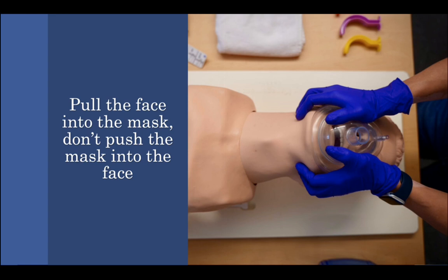So remember, pull the mask up and in, pull the jaw up and into the mask. Don't push down on the mask into the face. Now, if you're bagging someone and you still are having a hard time, you can pad under the head and get them in that sniffing position. That can improve your airway dynamics. Don't forget to use an OPA because the biggest failure of a BVM is lack of using an OPA.